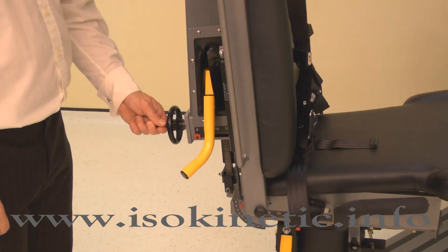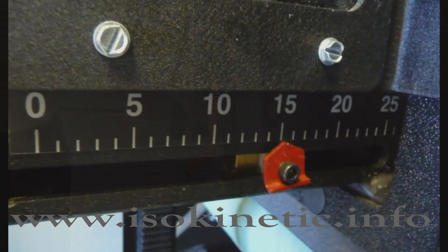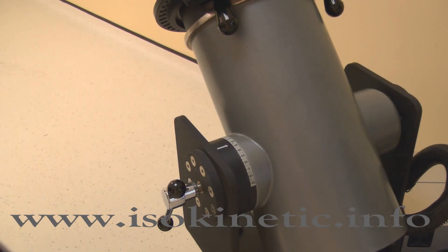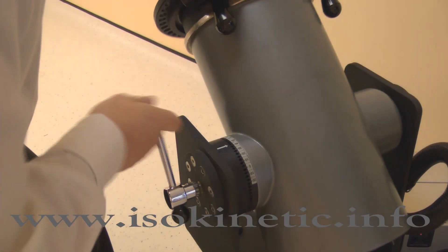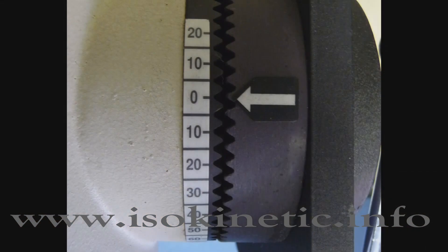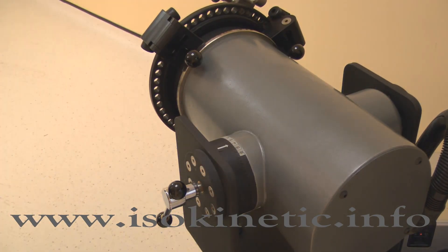Set the chair back translation by winding the handle. For the knee, adjust the chair back translation to position 15. Set the seat to the up position by lifting and releasing. Now set the dynamometer tilt — release the locking handle, then change it. For the knee, adjust the tilt angle to 0 degrees. Lock by tightening the handle.